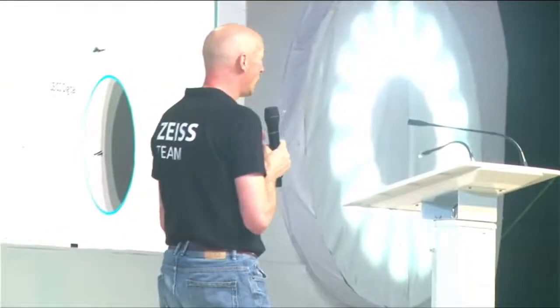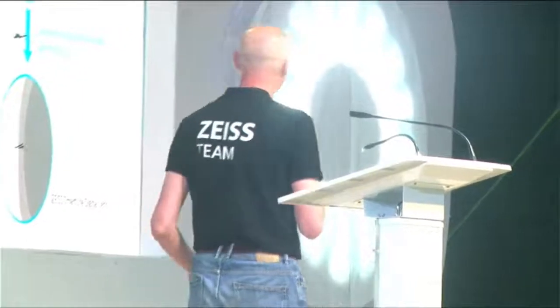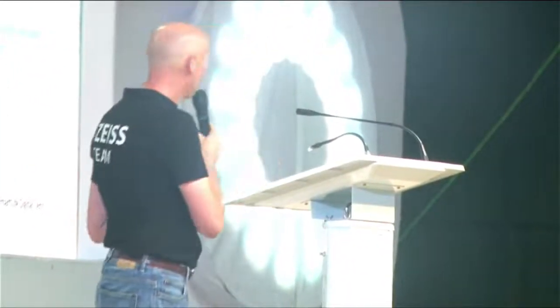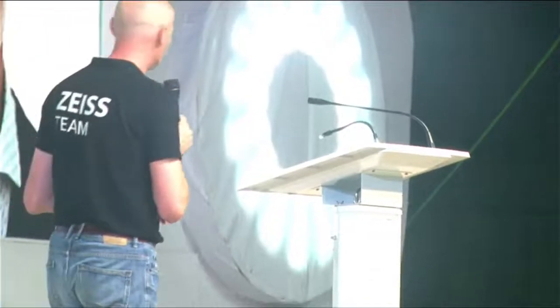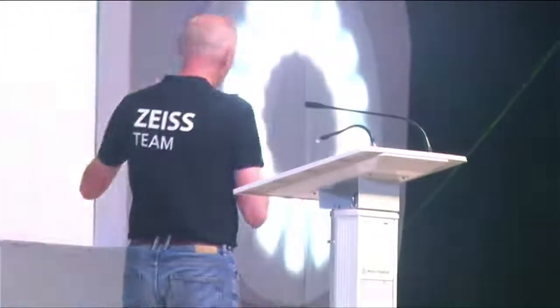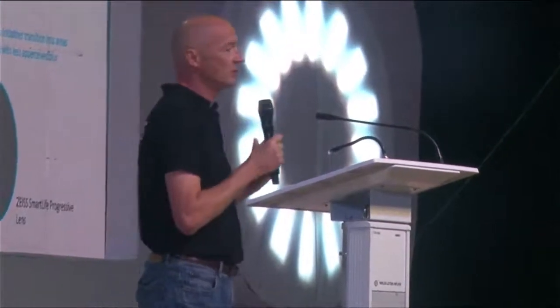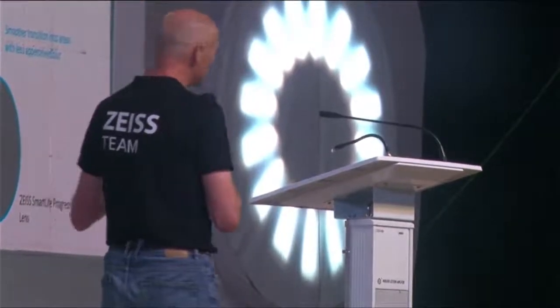So to show you a design, this is our previous design. The aberrations were much higher to the sides. So we have softened them out and we pushed them a little bit up to the upper side. And this allows us actually to keep our binocular vision when we move our eyes to these aberration zones. And the last group is the progressive lenses, actually. The same slide, actually, with higher aberrations than in the digital, of course, because now we give an addition, not any longer a supportive accommodation, and we soften them out again.